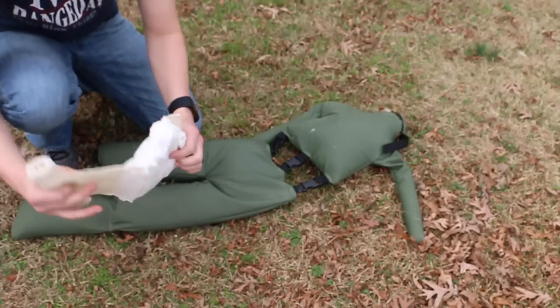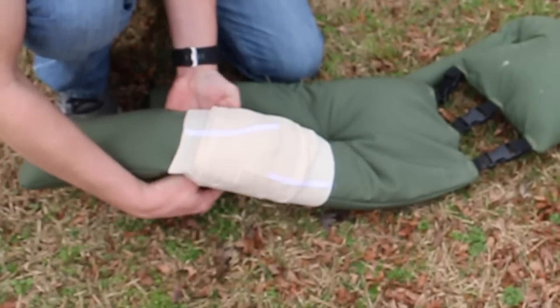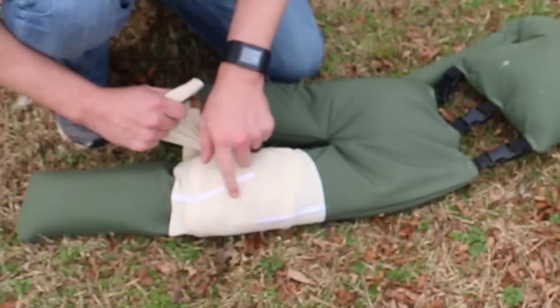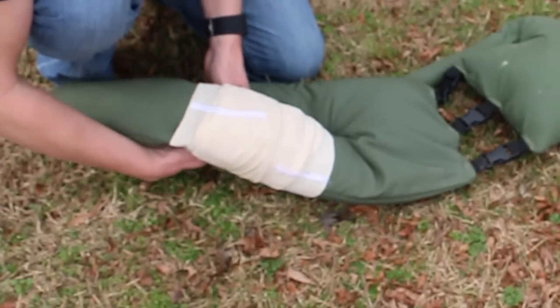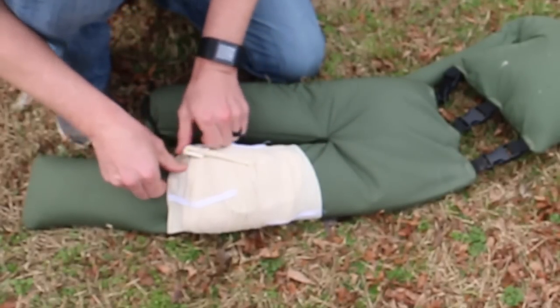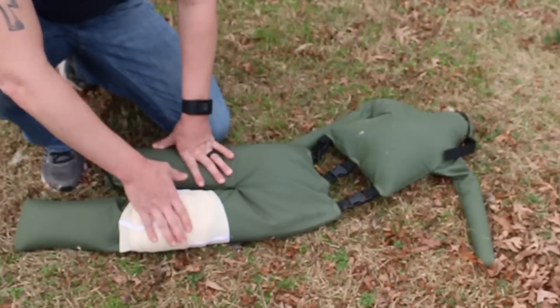Put this where the injury is, pull it up, and then make the bandage nice and wide. If you want to create a little bit more pressure, you can rotate it to put the cup exactly where the wound is, because that cup is where we'd want to position over the wound. Pull it across just like that. We've found the end of our pressure bandage and can use this to lock into place by pulling the last strand together. Now, this is a pressure bandage, so we should still have a distal pulse and good capillary refill past this - we're not creating a tourniquet here.